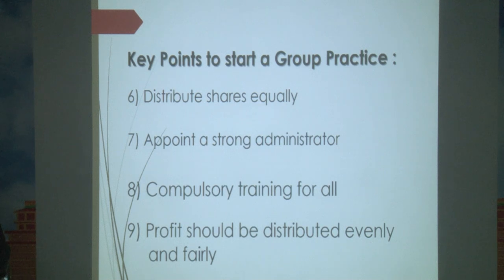After coming, one more interesting thing what we did is, we called that time the five giant people company were there, Alcon, AMO, Schwind Amaris, Zeiss, and even the NIDEK people. We have given 1 hour time to each and every company and said that you should tell about the positive thing about your machine, negative thing about others' machine, and what will be your lowest possible quotation. The same day, you should not negotiate afterwards. So that was the condition given to them. We had a marathon meeting from morning 9 a.m. till 5 p.m. And by the 5:30 evening, we were ready with our decision.